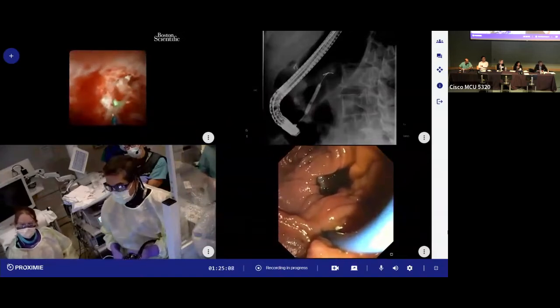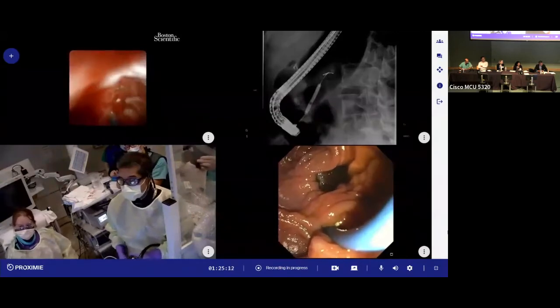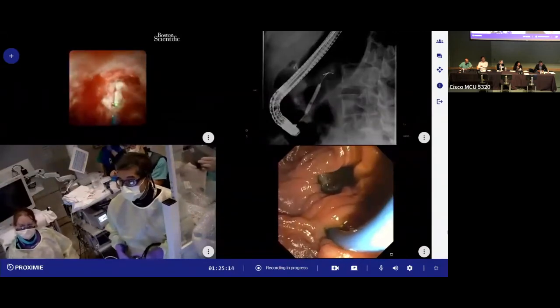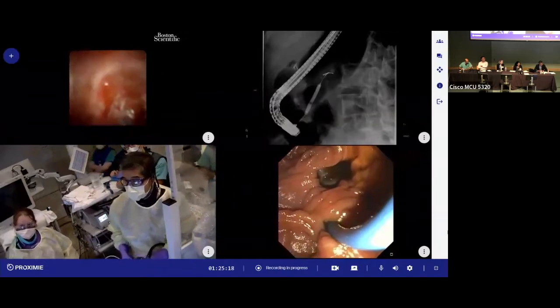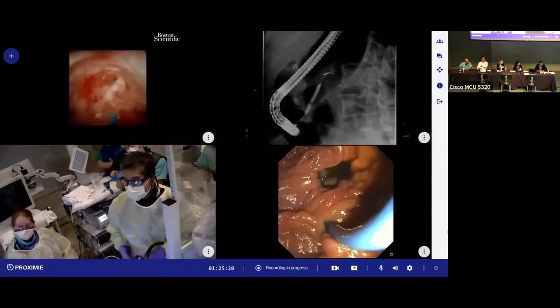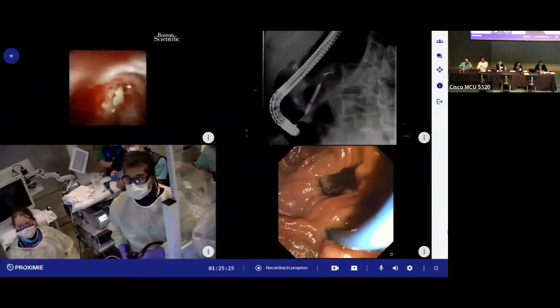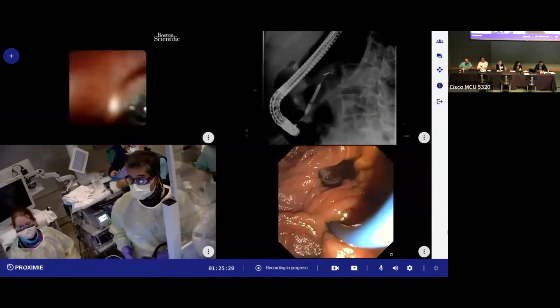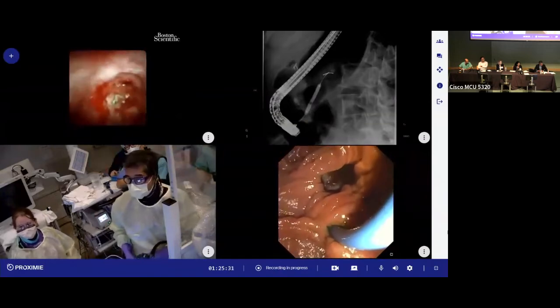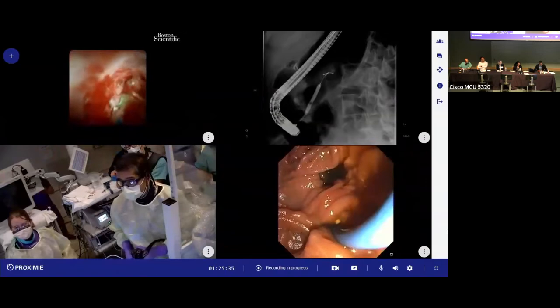But there's a very benign-looking stricture that we're going to treat using a soft tissue setting, to do just a minimal stricturoplasty. What we're trying to do is open up the duct just a little bit more to improve position for cutting. So I'm trying to get from distal upstream to downstream, and basically we're just ablating fibrotic tissue.